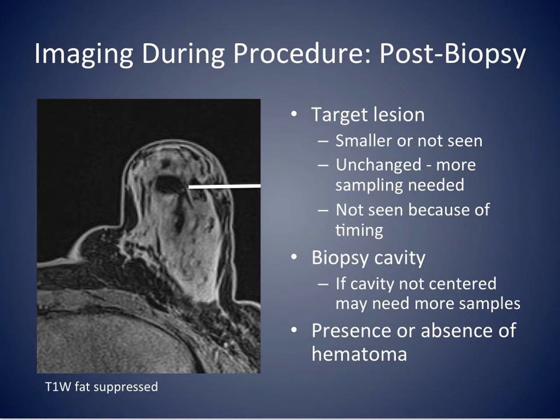Post-biopsy imaging is performed after the biopsy device is removed and replaced with the obturator. This imaging is important to evaluate the interval change of the targeted lesion, the location of the biopsy cavity, and the presence of a possible hematoma.